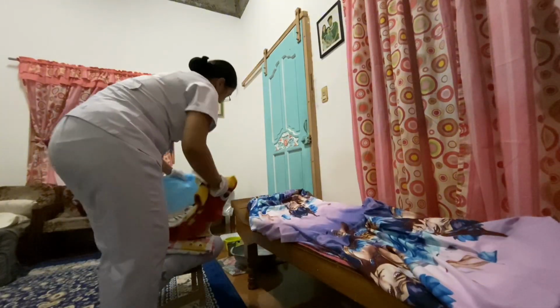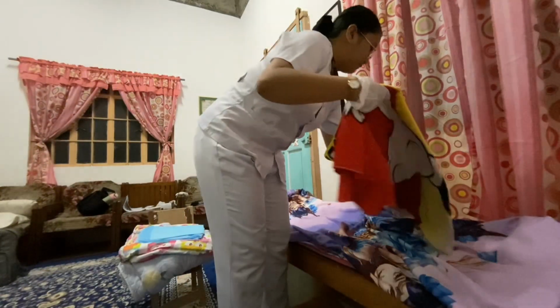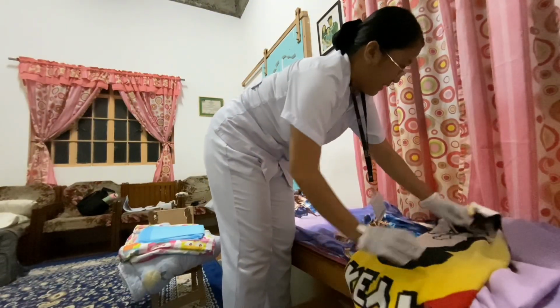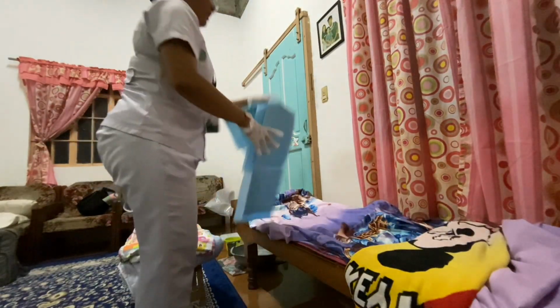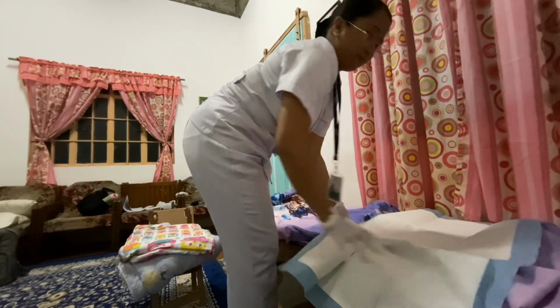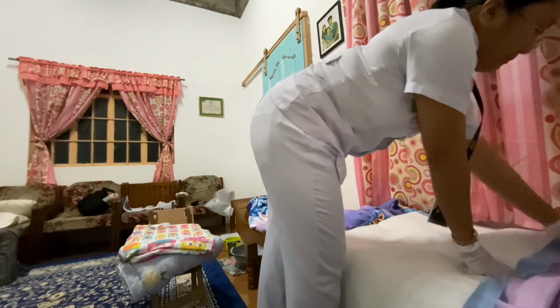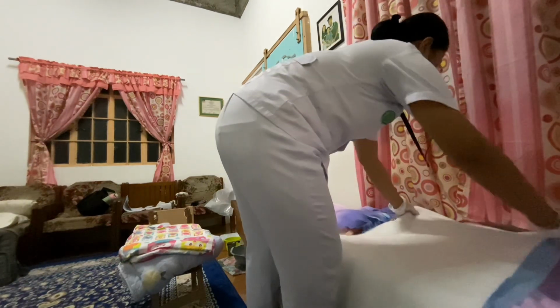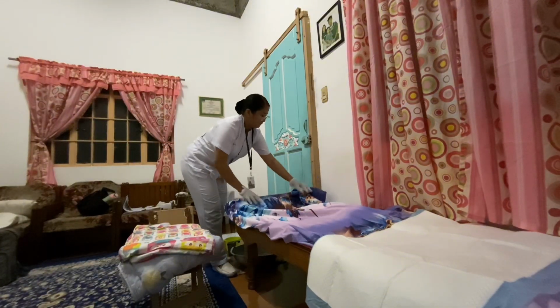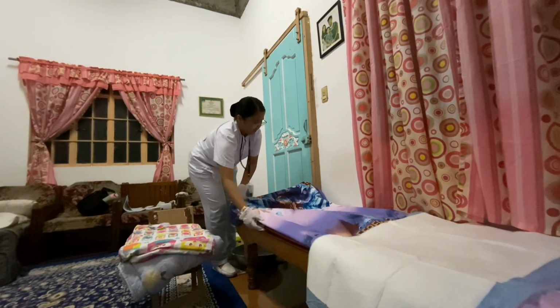Then, yung ating first, ito po yung magiging side ni client. Then maglalagay din po tayo ng underpad, if gagamit po siya ng underpad. Then saka po natin iaayusin yun, aayusin sa pagkaka-center fold. Next, I'm going to pull the bottom sheet over the corners at the head and foot of the mattress. Having bottom linens free of wrinkles reduces patient discomfort.